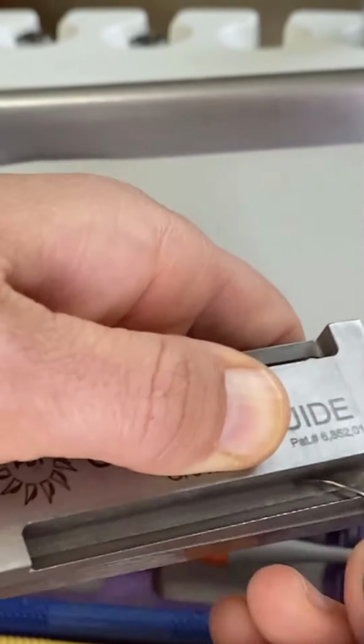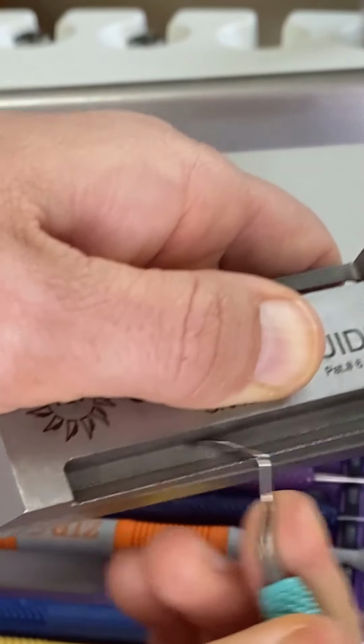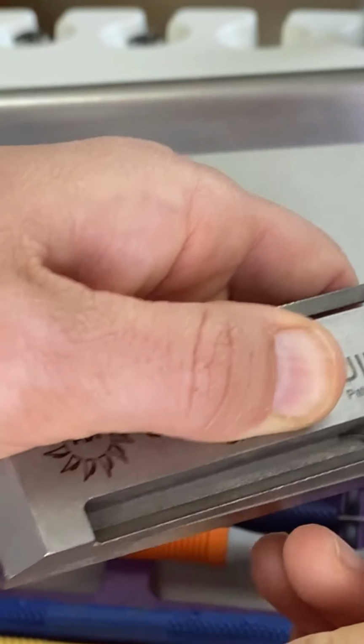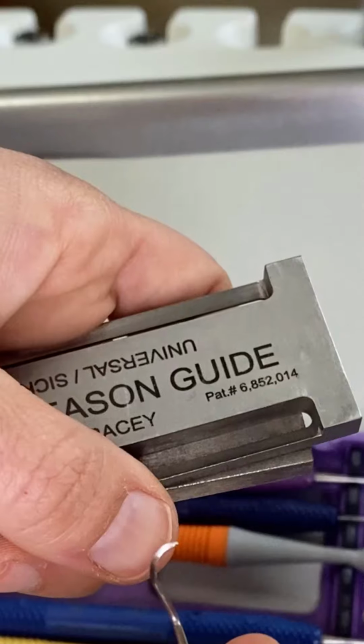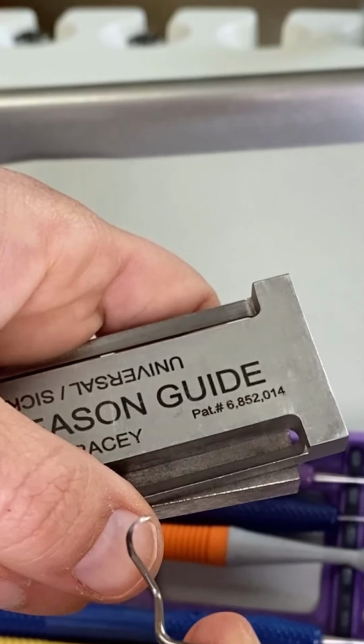And if you have multiple cutting edges and you're using this for the first time, I'll be the first to tell you you might be here for a hot minute just to even them out. But then I use my light. Look at that lovely little cutting edge.